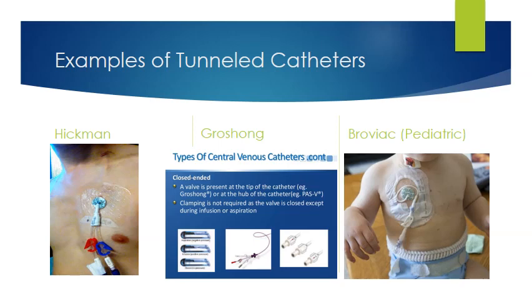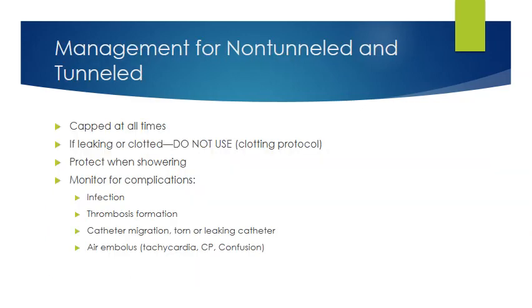And then the last one I'm just going to mention, we don't focus on pediatric in this class, but this is called a Broviac, and it's just a smaller size, and it's what we use on little kids.